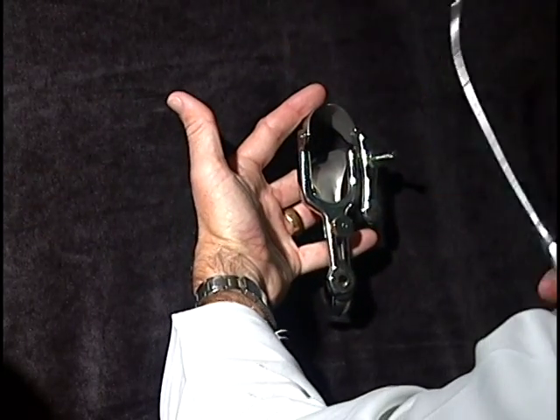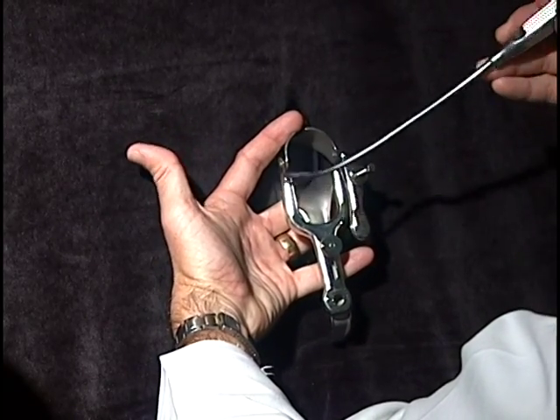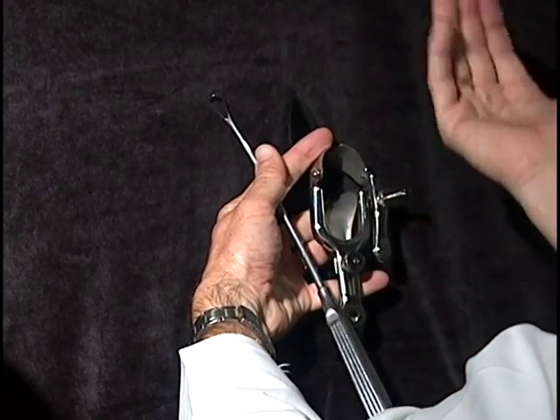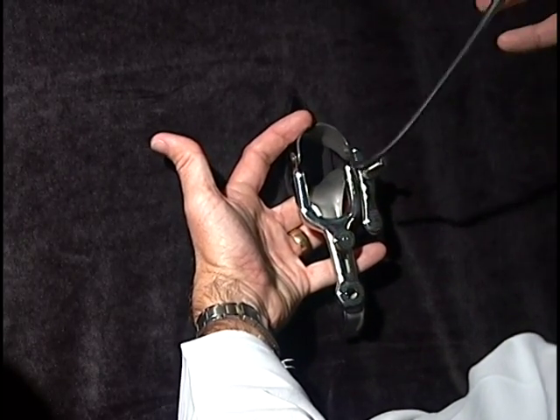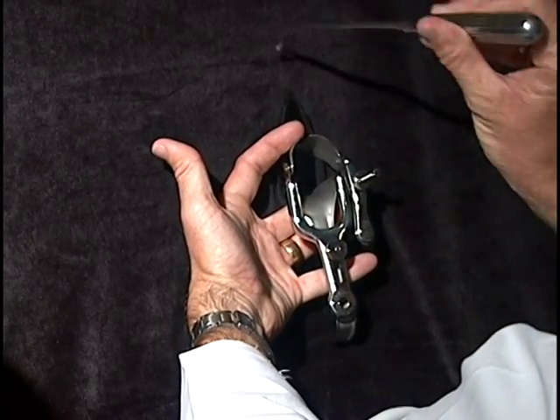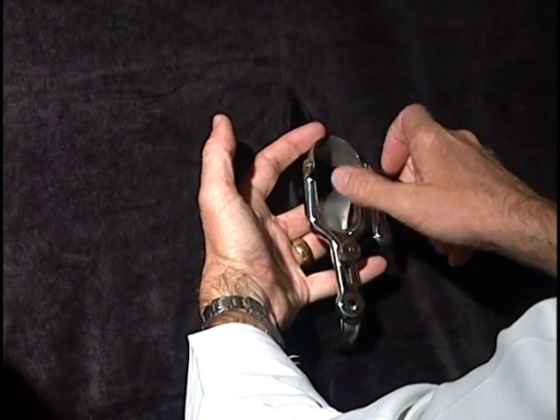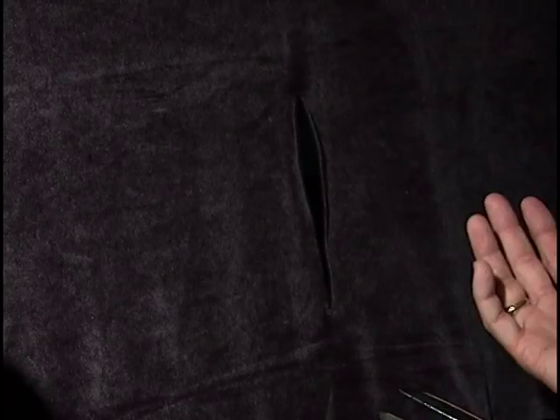Once that's finished — we mentioned one of the complications being Asherman syndrome — this is a curette. You can see it's sharp on the edges and rounded. Its job is to scrape the lining of the uterus for any remaining pieces of placenta and blood clot. It is passed up through the cervix, into the womb, and scraped around all sides to remove remaining tissue. Then the procedure is finished, the speculum is closed and removed, and the first trimester abortion is complete.